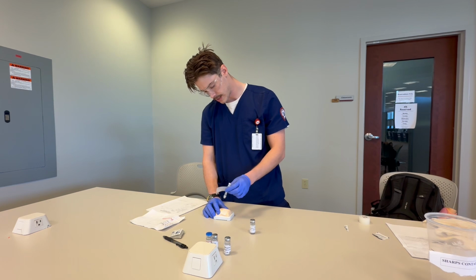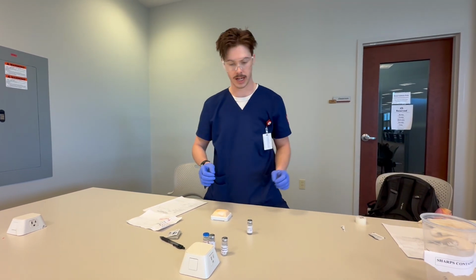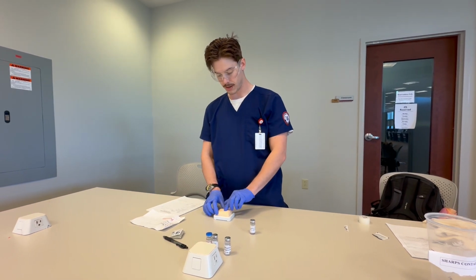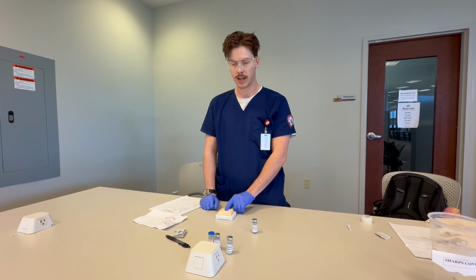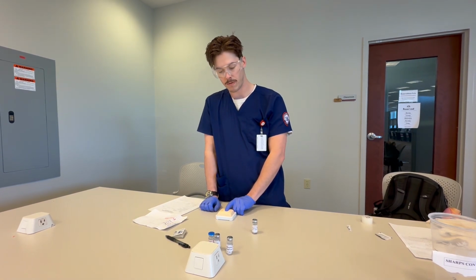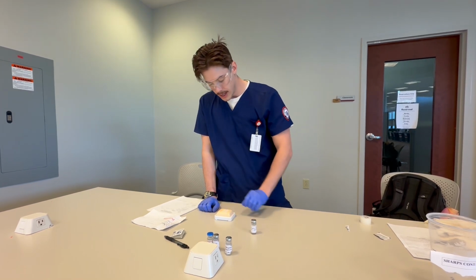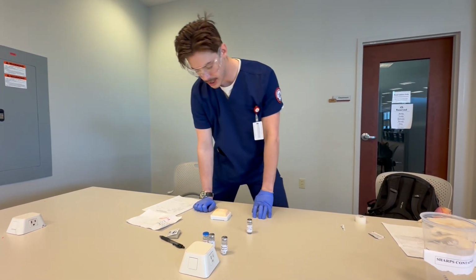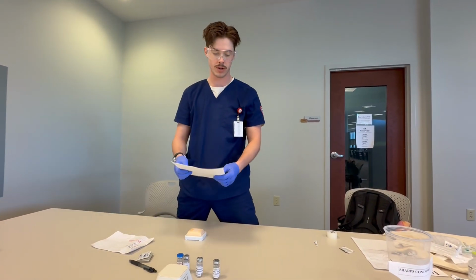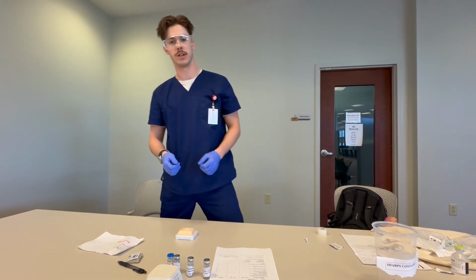Aspirate. And right into the sharps container. All right. Go ahead and swipe down and hold pressure. Mr. Jones, how did that feel? Was that tolerable for you? Yeah, that was fine. All right, you are good to go, Mr. Jones. Have a good day. I will wrap up, take my stuff with me, and then go report to the nurse's station how Mr. Jones tolerated the procedure.